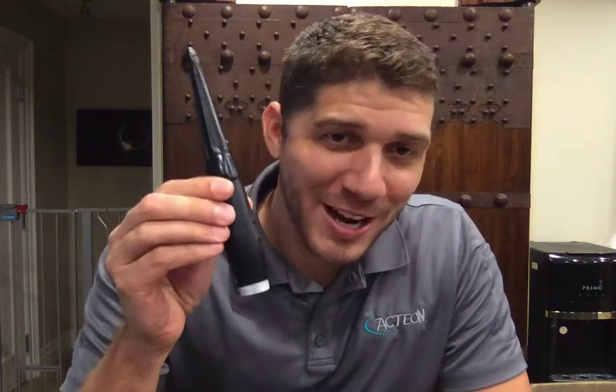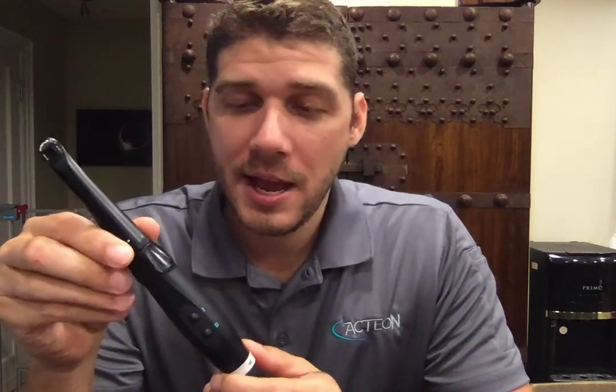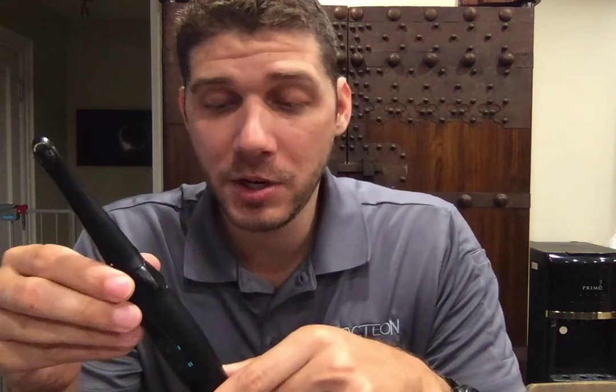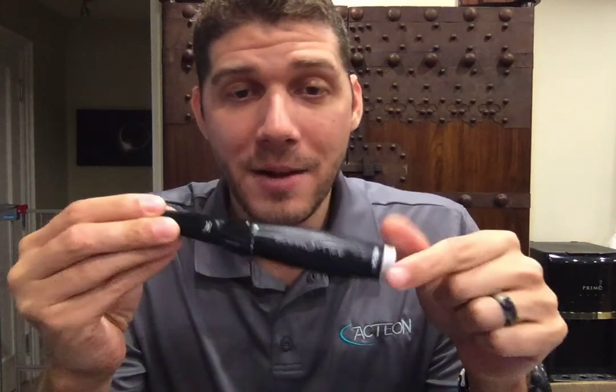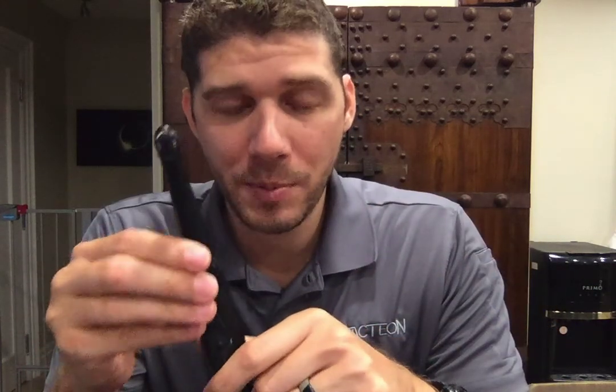Hey, I'm Kevin with Acteon. First off, congratulations on your new SOPRO Life camera. This is one of Acteon's diagnostic cameras — a fantastic camera. It has our diagnostic feature that features two levels of caries detection. In this video, I'm going to show you how to make the best of this camera and how to use it to its full capabilities.